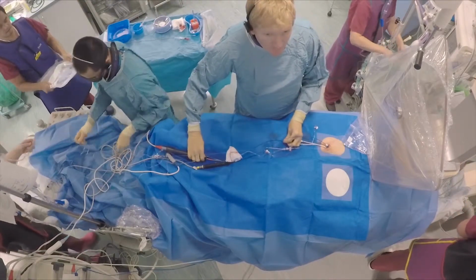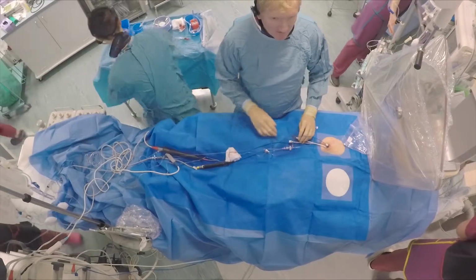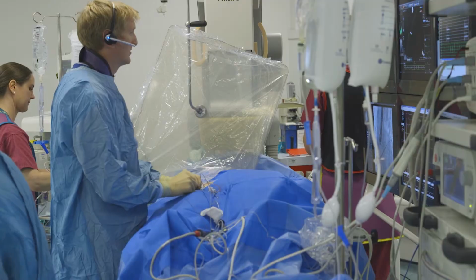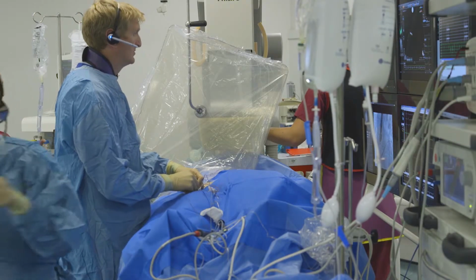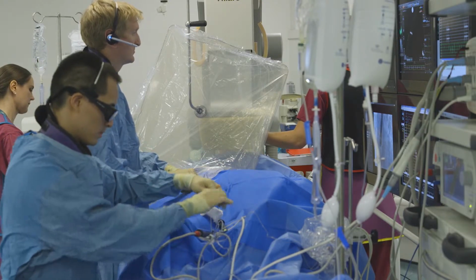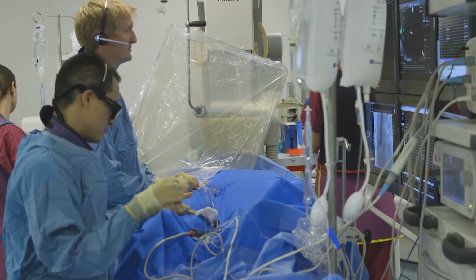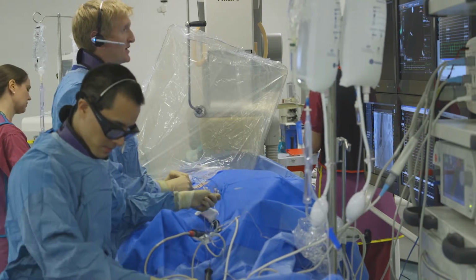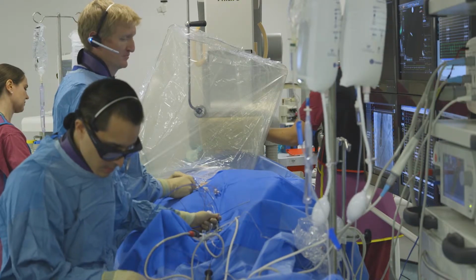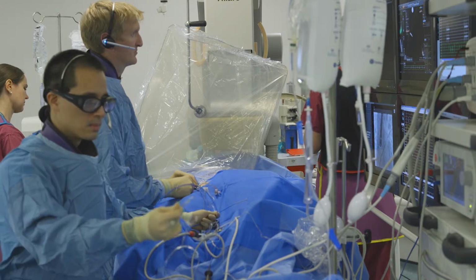Once you have the wire in the pulmonary vein, it is not necessary to continually use fluoroscopy, especially when using the transesophageal echocardiogram. Heparin is given immediately after vascular access, and we tend to give around 8,000 units. This is then done immediately after the transeptal puncture, aiming for an ACT of above 300 and less than 350.